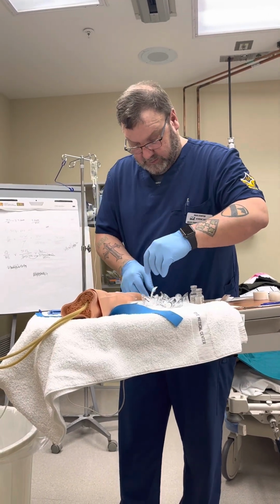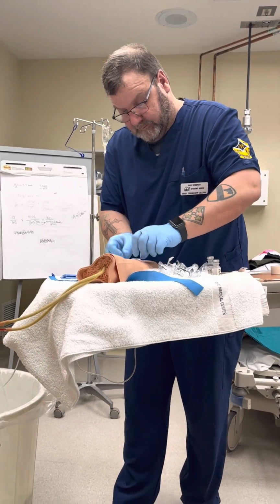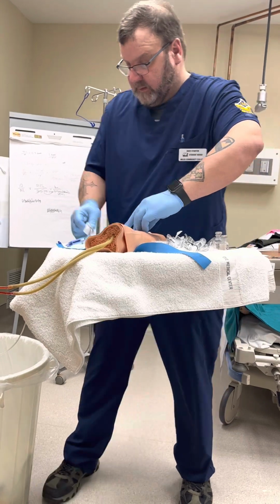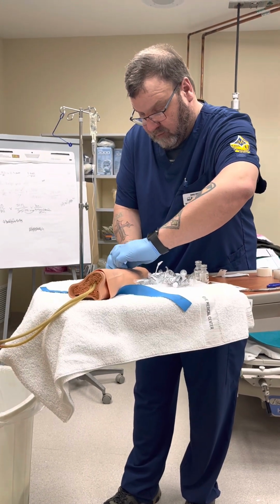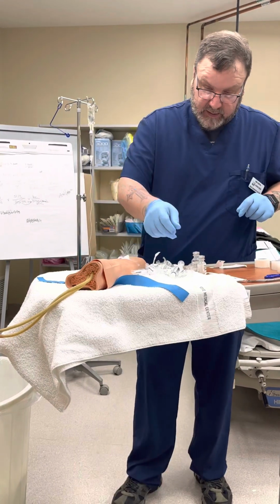So I am going to take a piece of gauze and put it under this IV line. Going to disconnect the IV line. I'm then going to take my alcohol swab and clean that port and let that air dry.